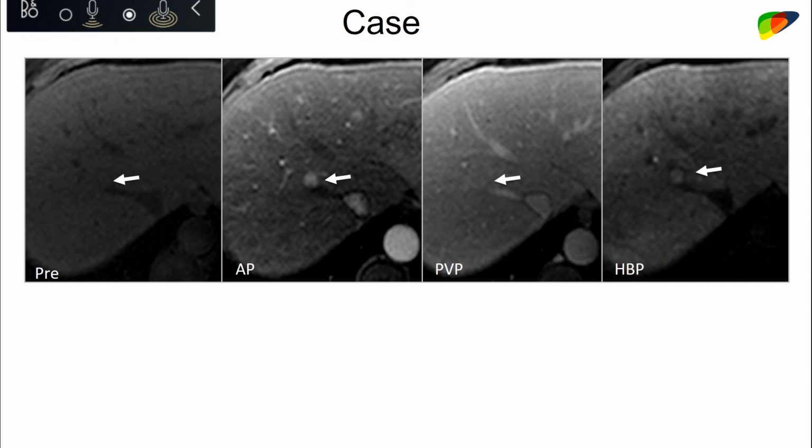But you can see that there's many things that suggest that is the case. There is a non-enhancing capsule, which to me is highly suggestive. There's also diffusion restriction, which is highly suggestive. So the presence or absence of another lesion doesn't sway me one way or the other for this specific lesion. I personally go lesion by lesion. I think the other one also is LI-RADS 4.